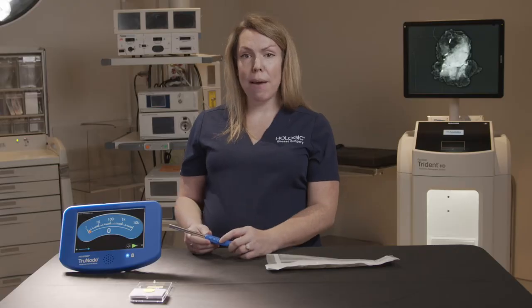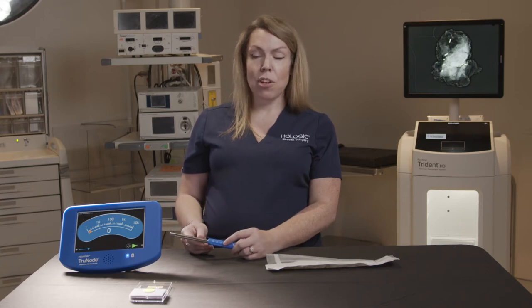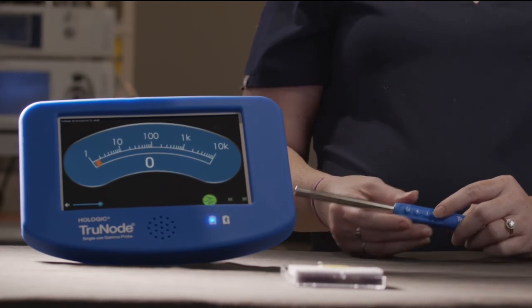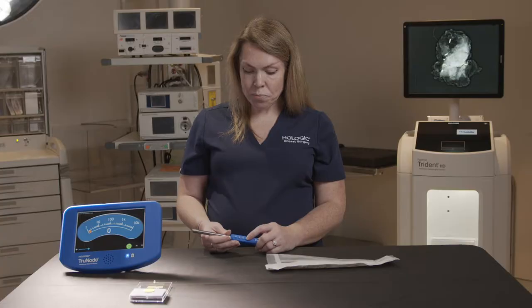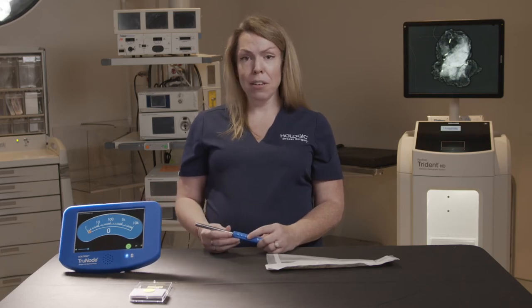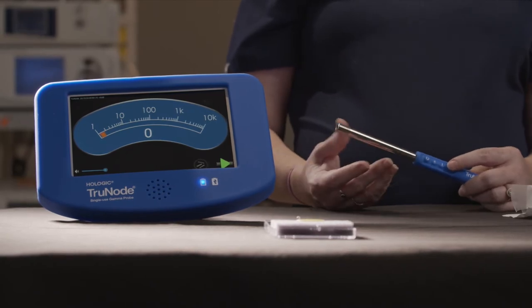Now moving on to the long presses. If we actually hold the M button in for approximately two seconds we can actually switch the UFU into seed mode. So now we're able to read I-125 seeds using our UFU. To go back into reading for Technetium-99, we can just hit that M button again and return to scan mode.